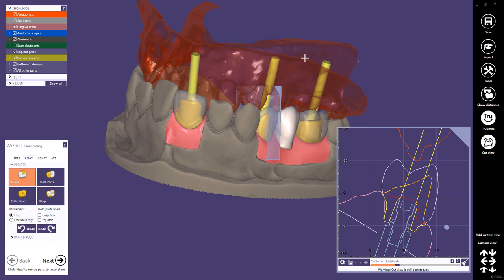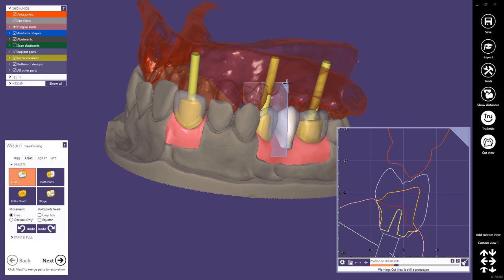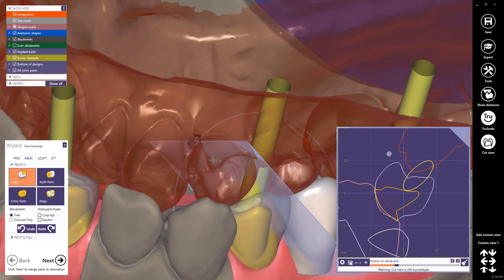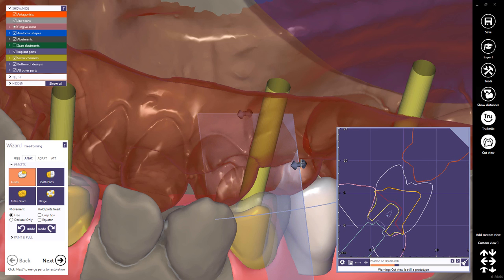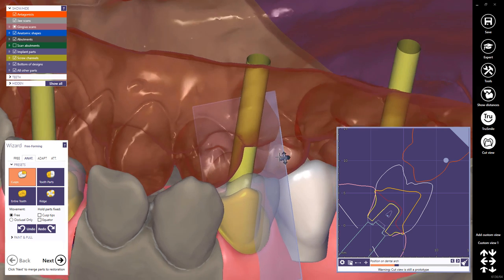Once the rectangle is positioned, you can move it by grabbing it at the corner. To rotate, you can use the arrow controls. Or hold Control and move the border. But there is also a quicker way to do it, as I will explain in the following.